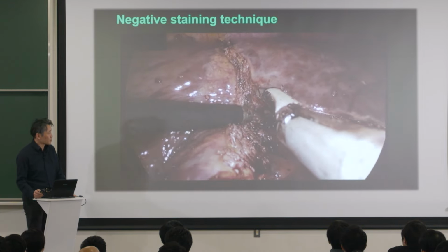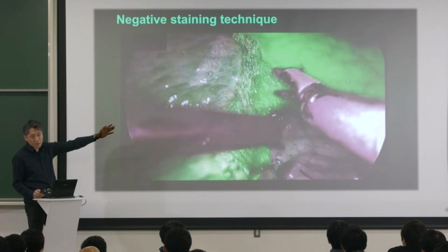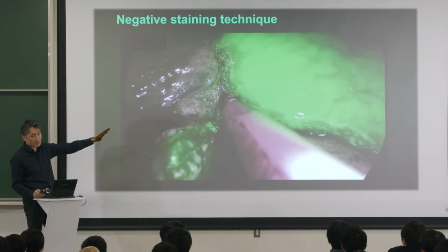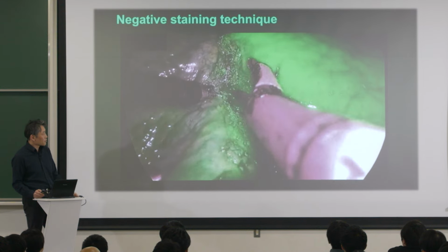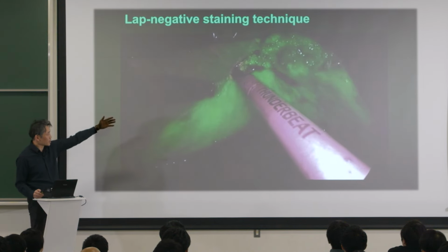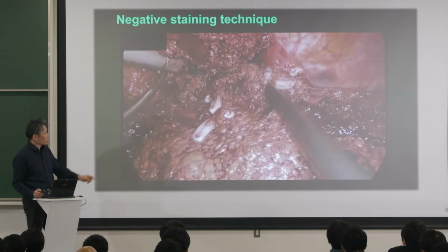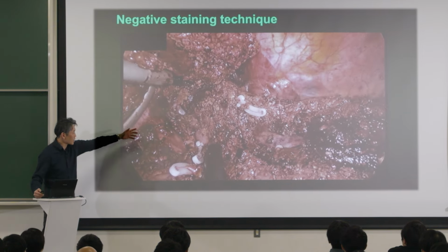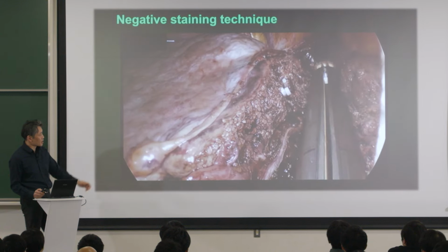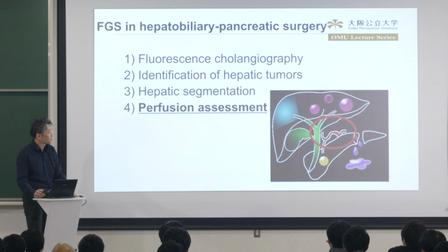And the advantage of the fluorescence imaging is that the surgeons can identify the accurate intersegmental planes, not only from the hepatic surfaces, but also during the parenchymal transection. Therefore, the landmark hepatic vein, this is the other side of the liver, the segment 2 and segment 3, appears on the hepatic raw surfaces. And finally, this root of the segment 3 is divided with a stapler device. And the really accurate segmentectomy of the segment 3 can be completed with the use of fluorescence imaging.